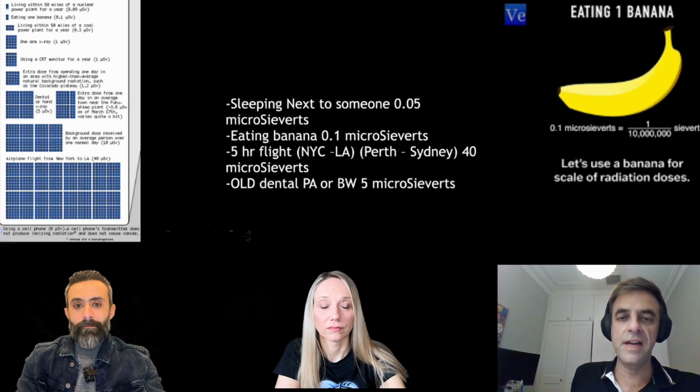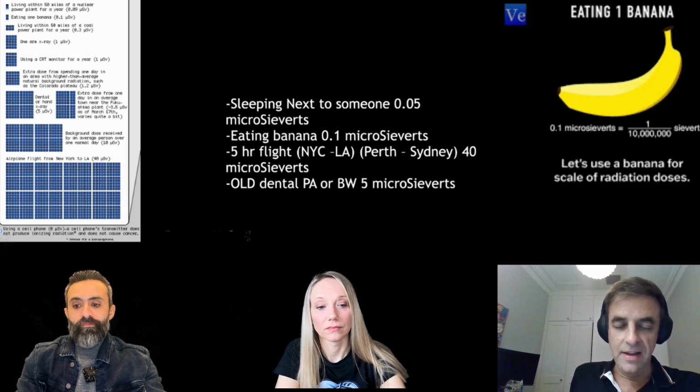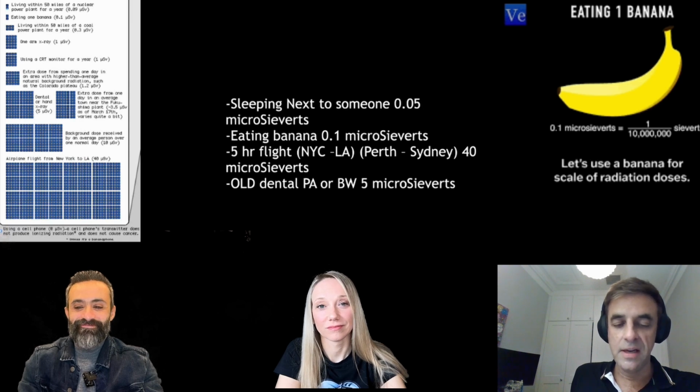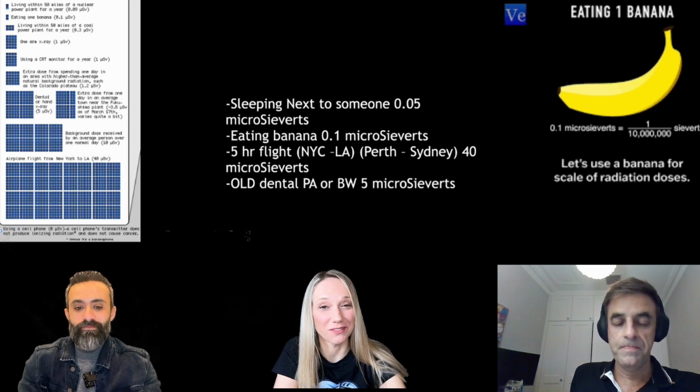And let's be fair, if we didn't have any discussion regarding radiation, CBCT would be taken on every patient. That's the only thing, because it gives you all the information. So what would you rather have, 2D and sort of some information, or 3D and all of the information? We'd rather have 3D and all the information. So the only thing we're talking about is a radiation dose. And if that radiation dose is insignificant, as I'm describing, then why not scan almost every patient? Makes a very good point, and that's quite interesting.